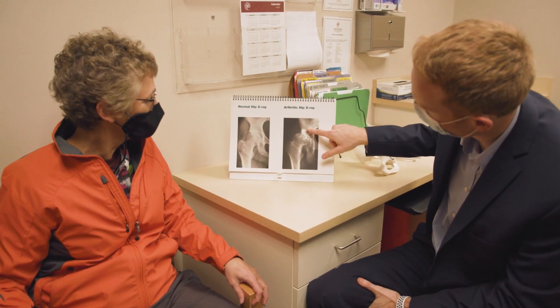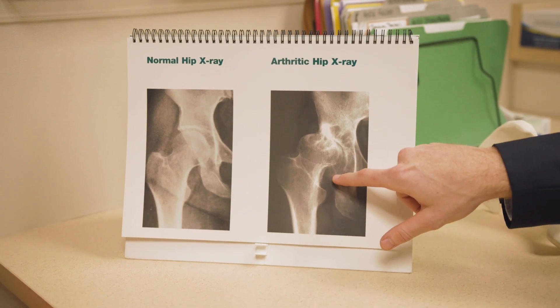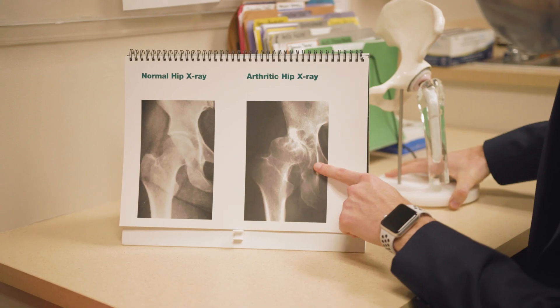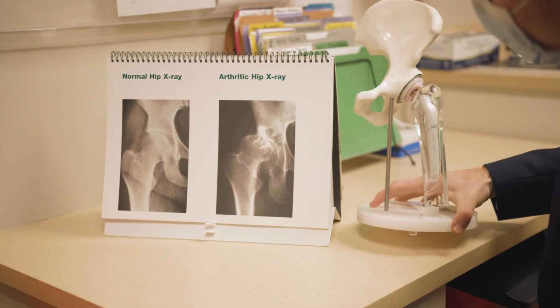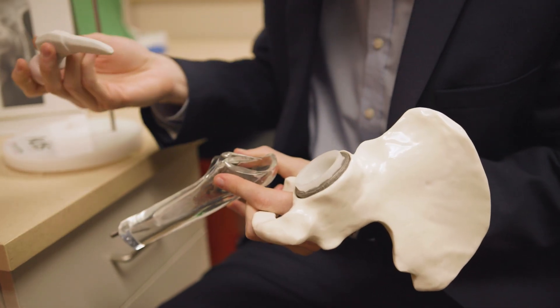Hip replacement surgery, regardless of whether it's anterior or posterior approach, really involves replacing the arthritic ball and socket joint. What we do is get down to the hip and then we essentially cut off the arthritic ball joint and replace that with titanium metal that goes down into the femur, or the thigh bone. On the socket side, we clear out the arthritis and replace that with a titanium socket with a surface that allows the bone to grow into it.